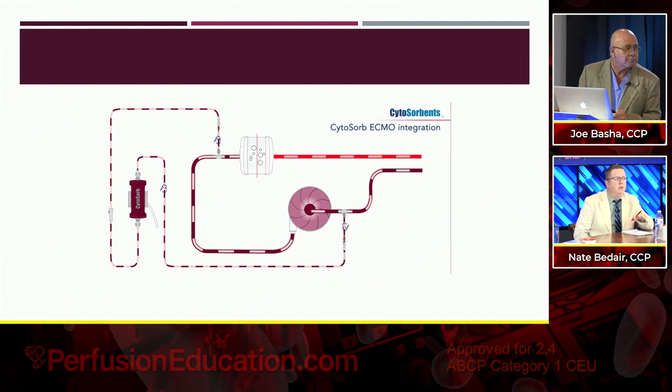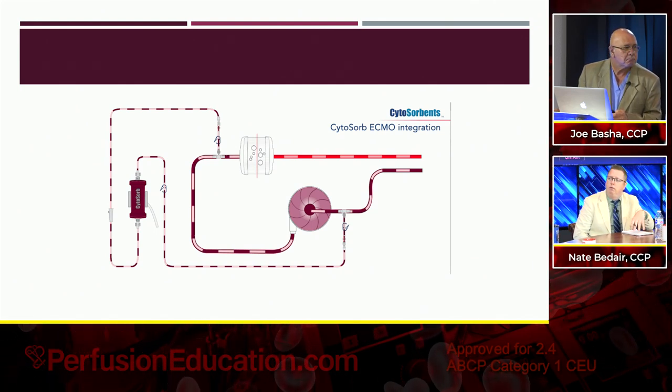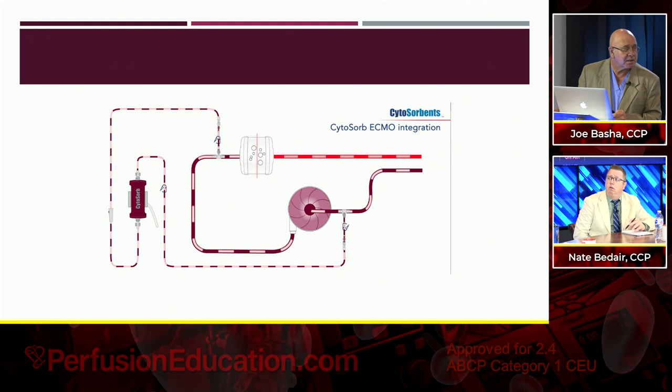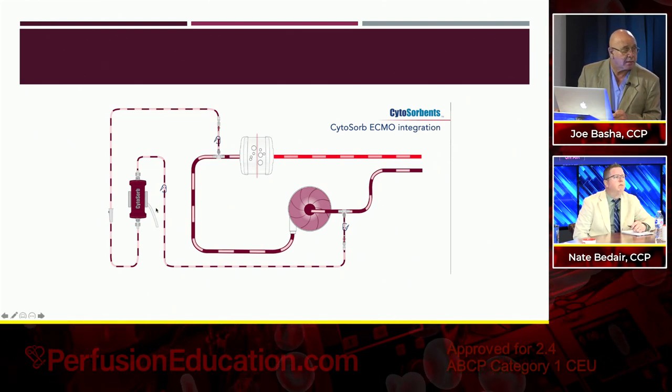You may be about to cover this, but can the Baxter device be used in the same manner? You mean the PrismaFlex? The Baxter filter you were talking about. Well, no, you have to use the CRRT machine, not in the same manner. So they are different in that way. Okay. Yes.